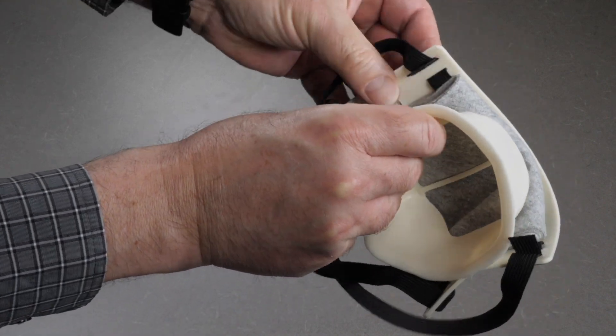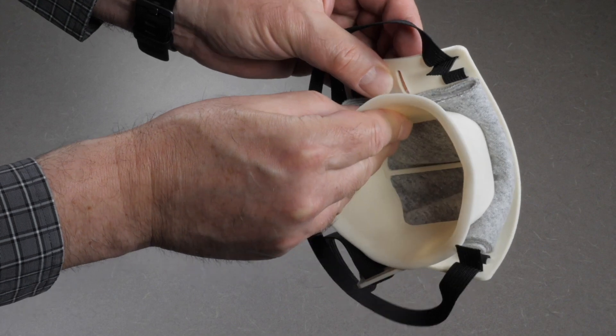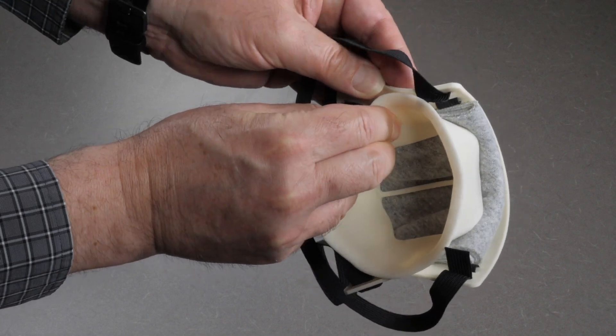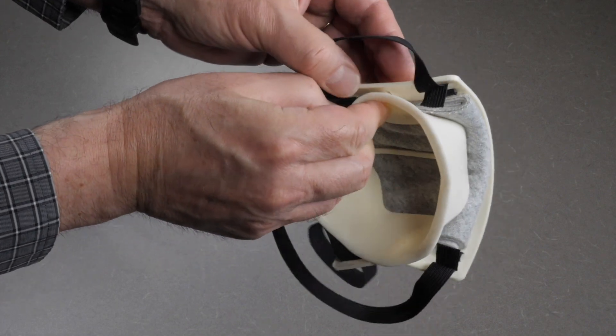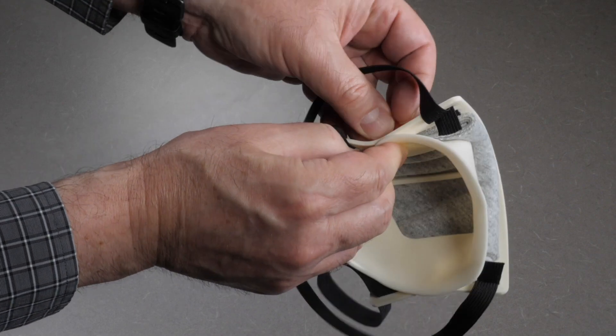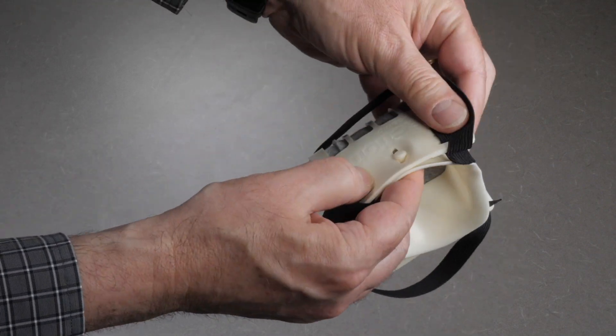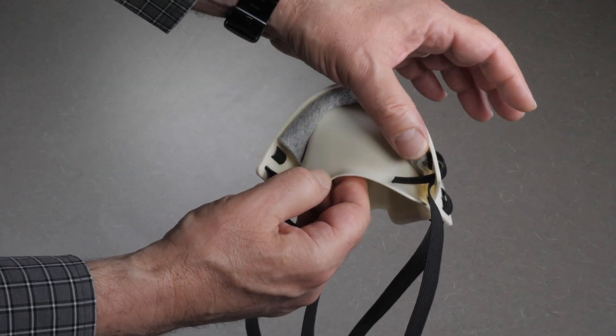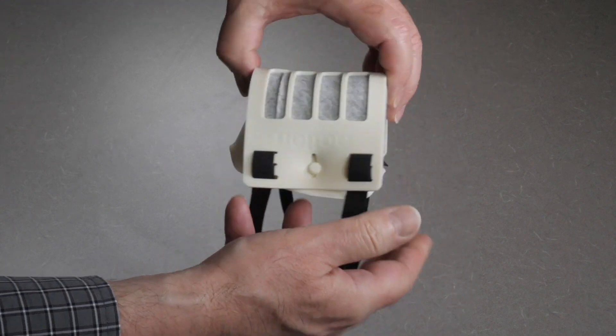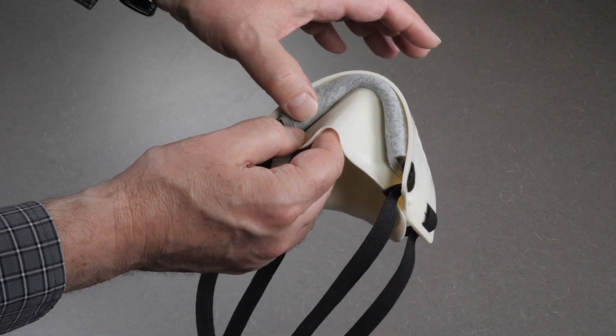Then snap the opposite side button on the base into the opposite side button hole on the cover. Make certain that the filter is even on the top and bottom of the cover.